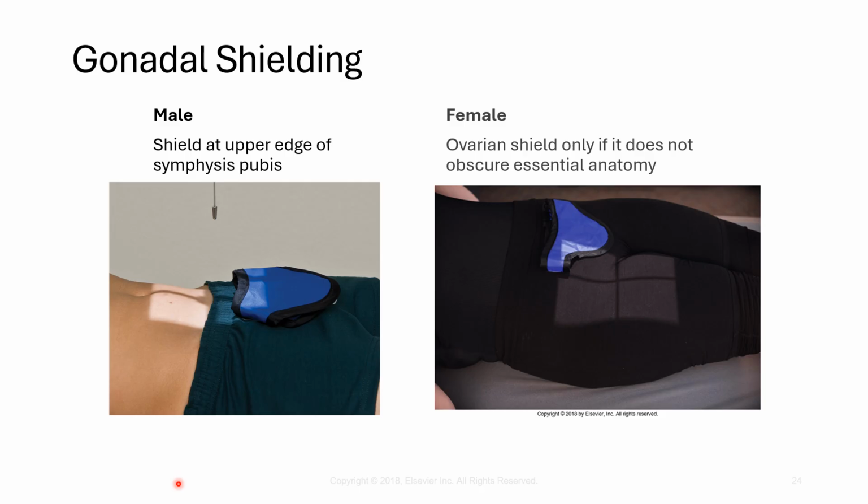Shielding has pretty much gone away in all the areas where we attend clinical sites, but somewhere else in the country, it might still be a work in progress. The registry does still recognize that shielding should be done. Until everybody agrees, eventually it will be taken off the registry, but that is not current practice.